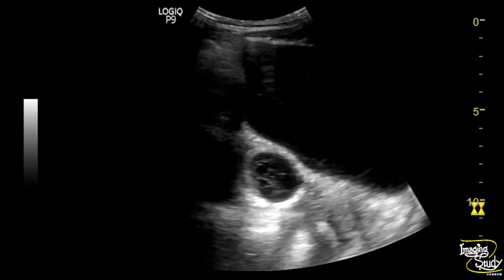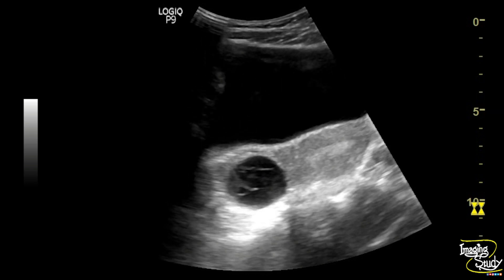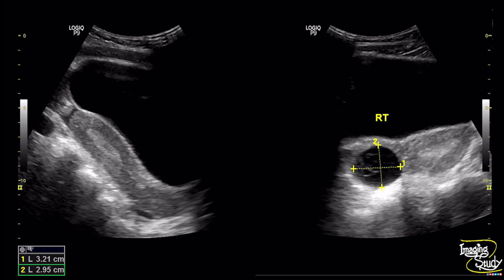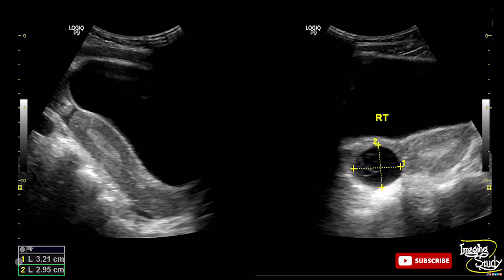Let's see some pictures of this case. This is the picture of the uterus in longitudinal section — it looks quite normal. Here is the cystic structure with internal reticular pattern. The structure is about 3.2 by 2.9 centimeters in size. If you magnify the image you can have very good detail of the lesion.